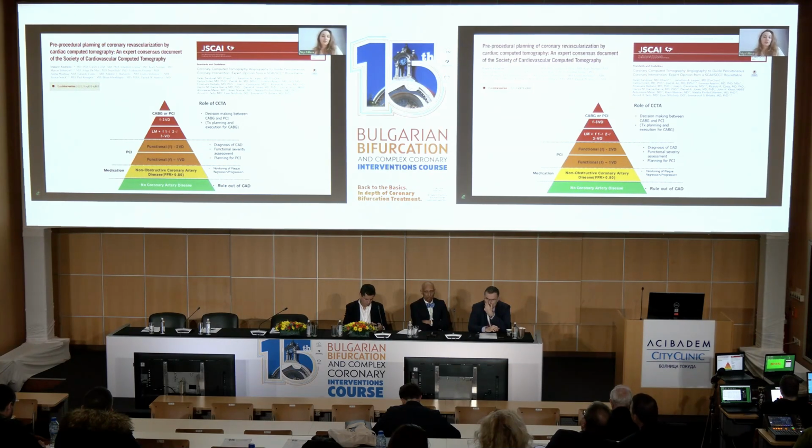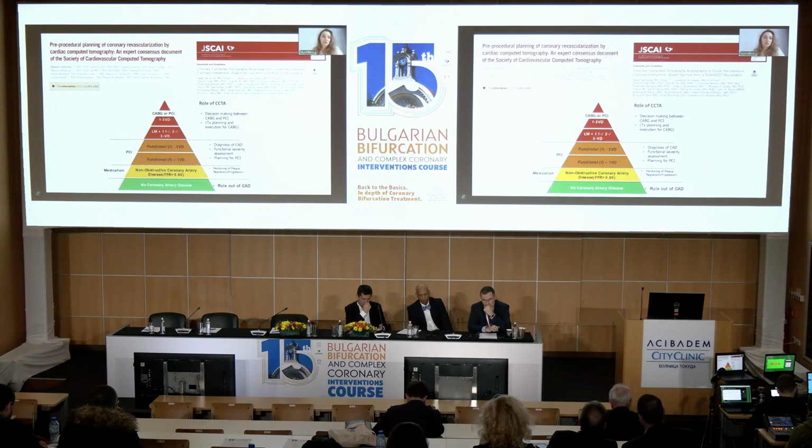And you see, they're not recommending the CT angiography just to rule out coronary artery disease, but also to tailor our medical therapy, also to plan our procedures and see what the best mode of revascularization is, if we should do surgical revascularization or percutaneous one, and also, you see, plan the most complex procedures of patients with left main disease and with bifurcation disease.